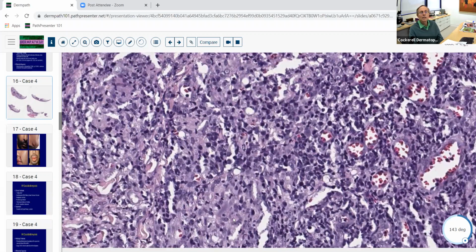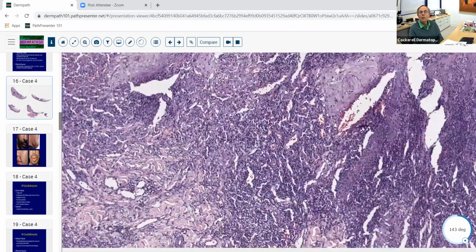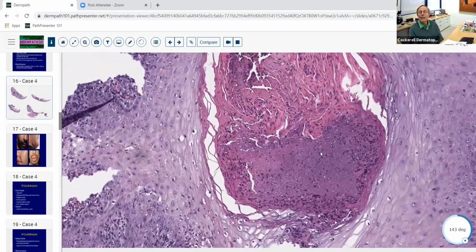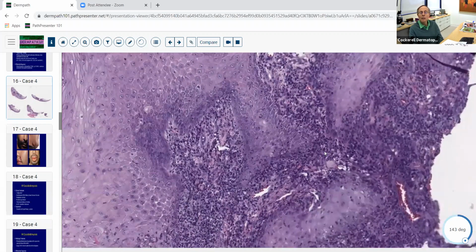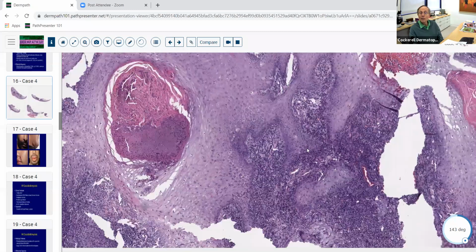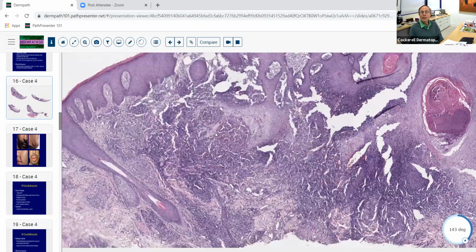There's a multinucleated histiocyte there. There are some other histiocytes here. There are a lot of neutrophils here. We're going to look up in the epidermis here, and we've got an area where there's an abscess within the epidermis. So that's another finding that you characteristically see in these infectious diseases. Another area over here where there are a lot of neutrophils. So this is an example of a suppurative granulomatous dermatitis. And when you see this pattern with the pseudoepitheliomatous hyperplasia, I want you to be thinking in terms of a deep fungal infection or possibly a manifestation of a cutaneous atypical mycobacterial infection.